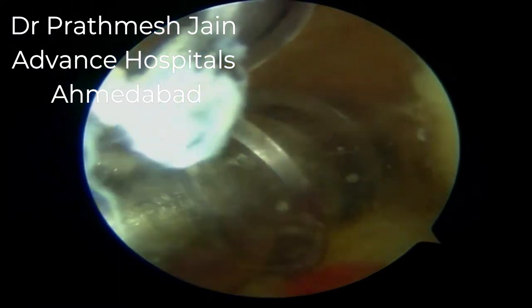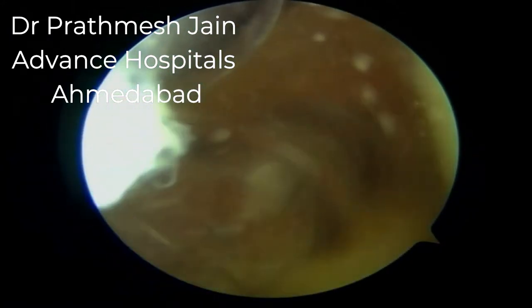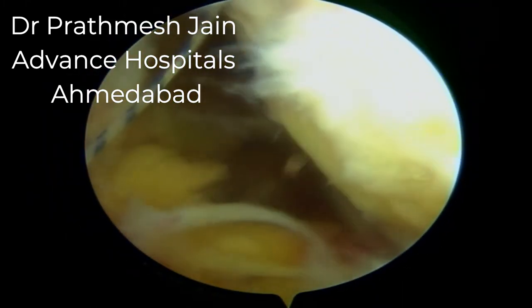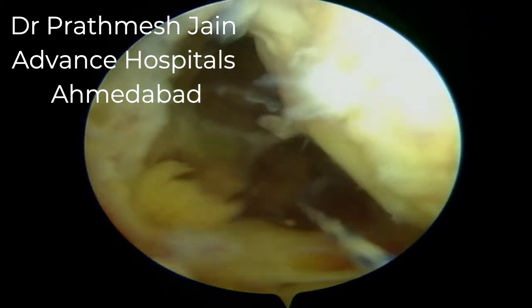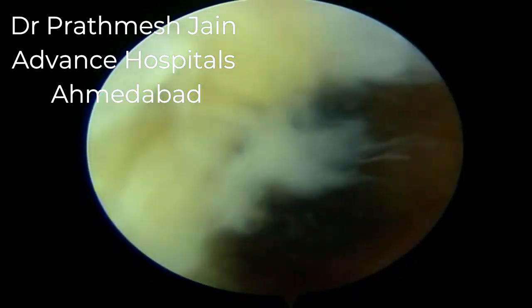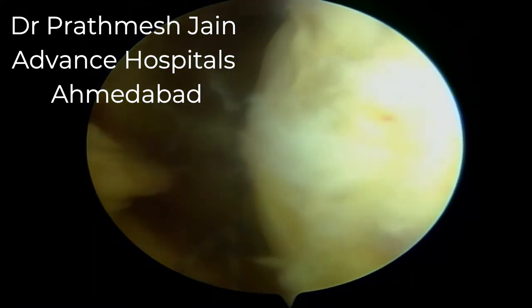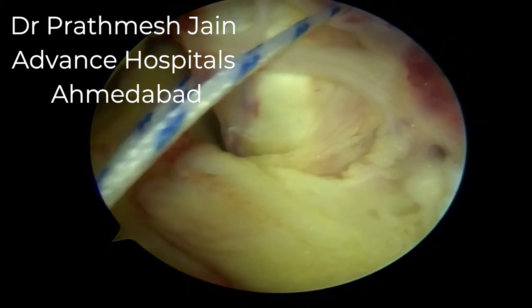Usually these two cannulas — the high posterior medial and low posterior medial — are sufficient to complete the entire surgical procedure. Occasionally a posterior lateral portal with a cannula is also made, but it is not utilized in all cases. We will now pass a number-two UHMWPE fiber wire from the top of the PCL, and the other end is routed via knot pusher from the inferior part of the PCL and taken back from the low posterior medial portal, capturing the PCL.